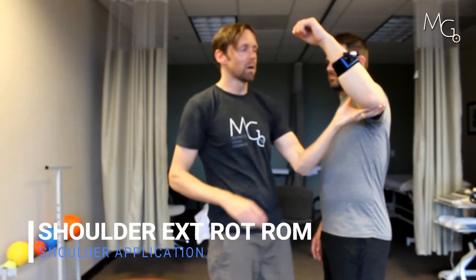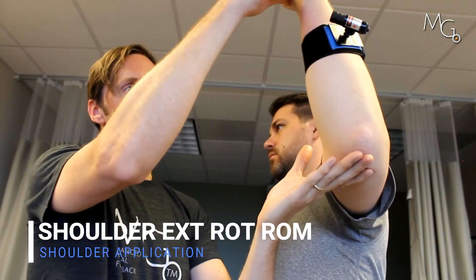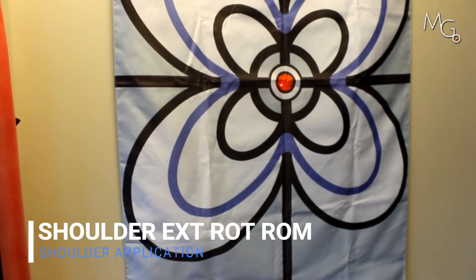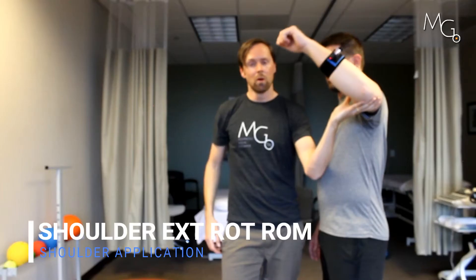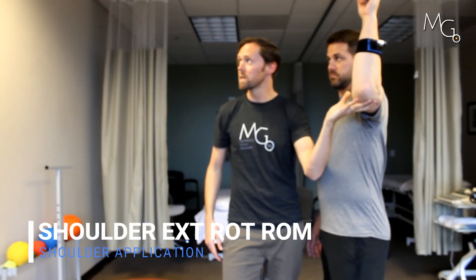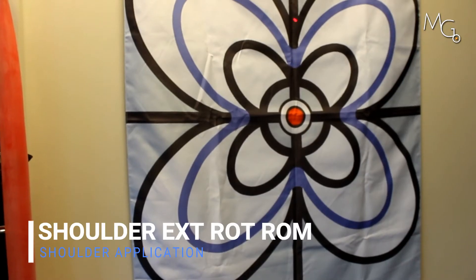If I want Chris to go higher and further into external rotation, let's move him back and tilt the laser down. Go ahead and move your arm back down, then get to the line again. Back down. Or I could encourage him to go into as much external rotation as he can — go ahead and raise that laser up as high as you can. There you go. Back down.